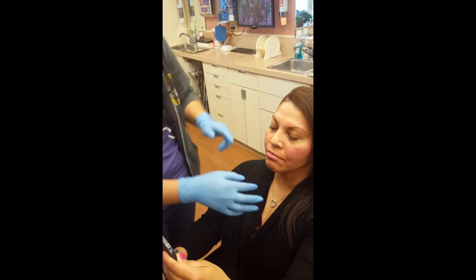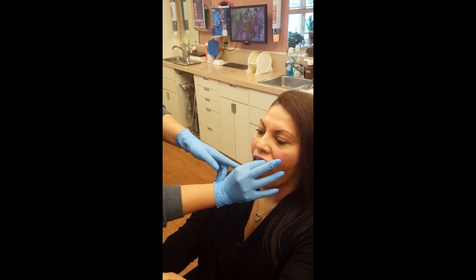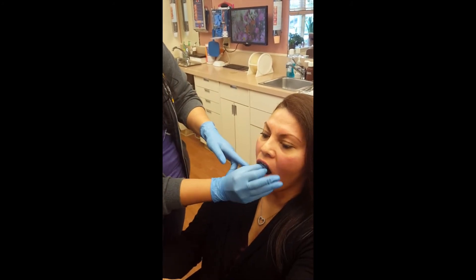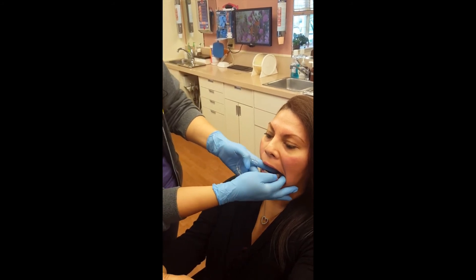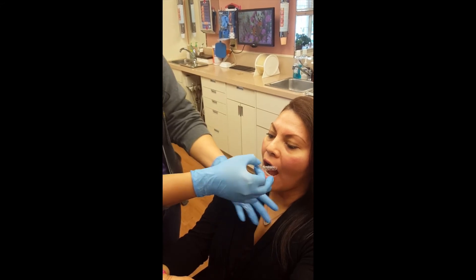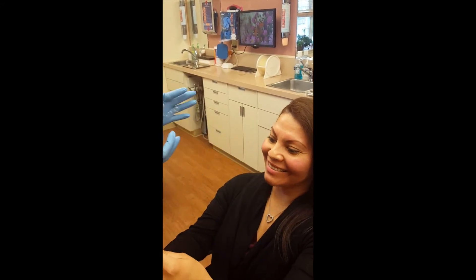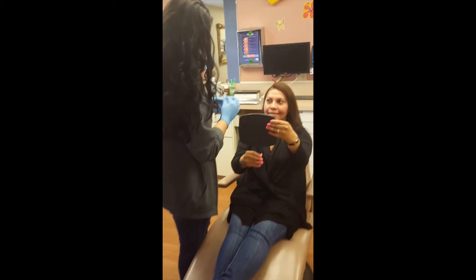I've got the upper and the lower. So to take them off, basically what I use is my finger here. I pop them off from the back, kind of peel it like an orange. I just kind of keep going. Same thing on the bottom — just kind of pop it up here. You can hear a little click and tell when they come off when they do a good suction. So basically that's all. Do you think you could do this on your own? Yes. Super easy and comfortable.